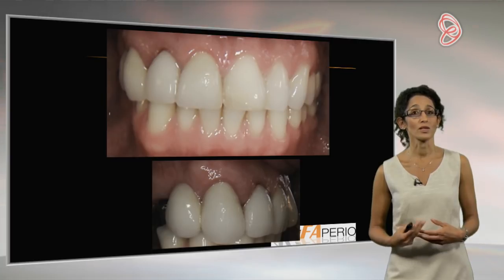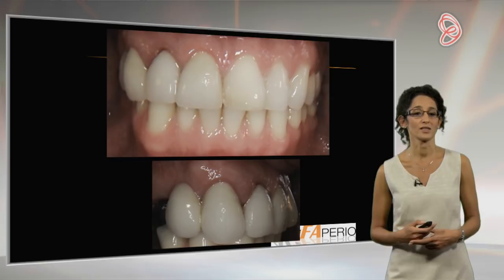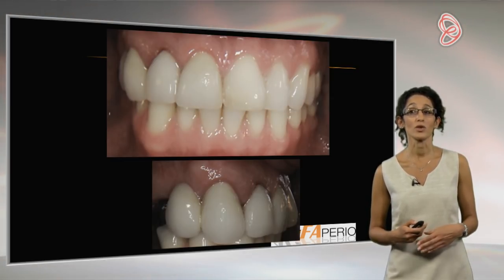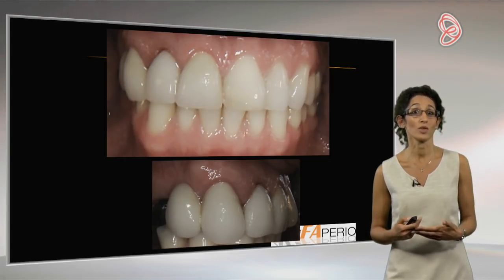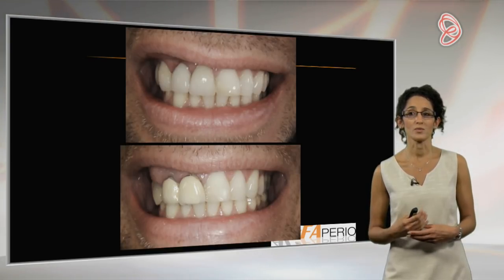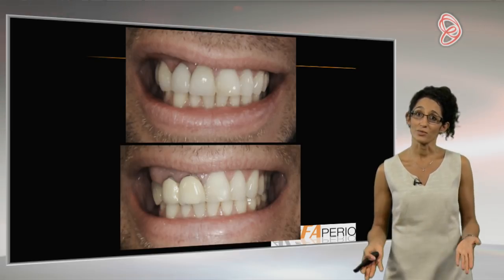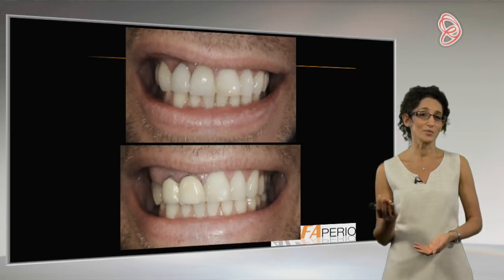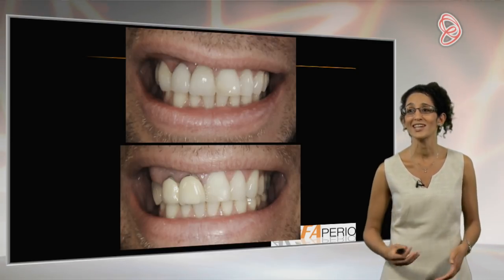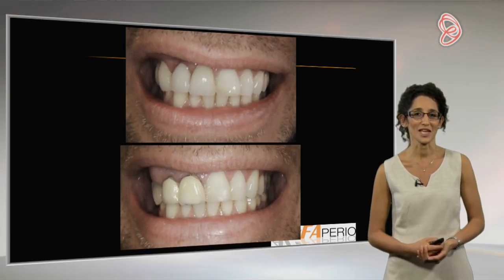If we look at how we've increased the length of that pontic as well, really nice fit. And hopefully if we've kept that bone distance nice and healthy, you can see how the tissues look lovely and healthy even with slightly subgingival margins. So that's him once he's been restored at the top compared to how he was to start with, which is great. And of course, in the world of cosmetic dentistry, how I always say when I present this case is that no doubt if you're a cosmetic dentist, you'll get your Botox out and just bring his right lip down a little bit, and then we have a lovely even smile.